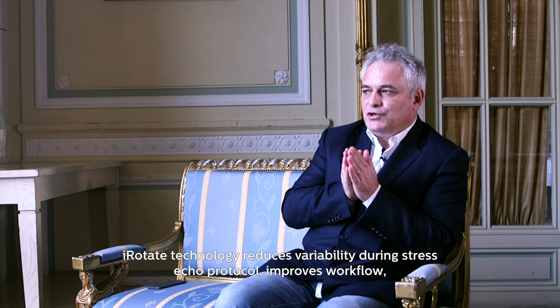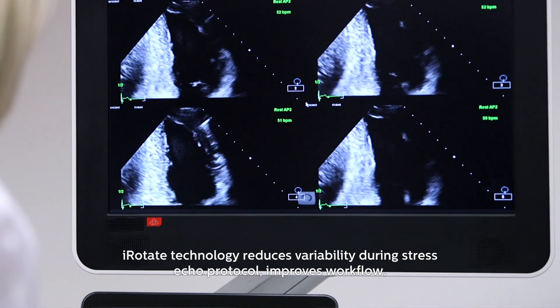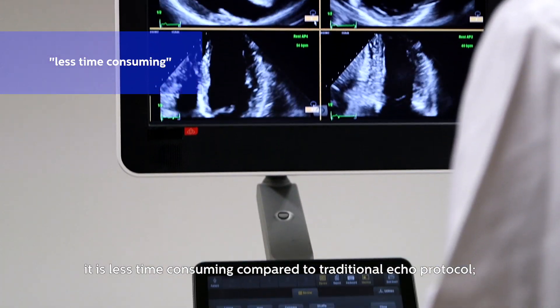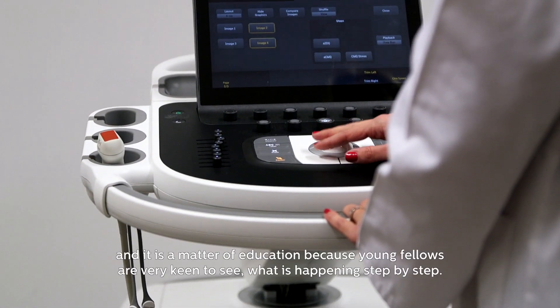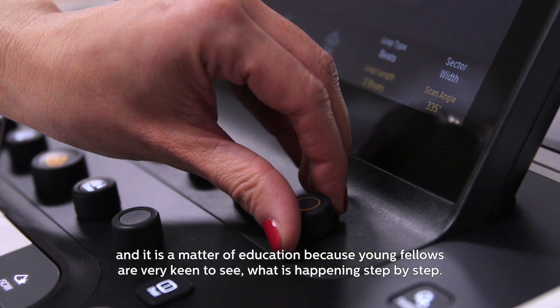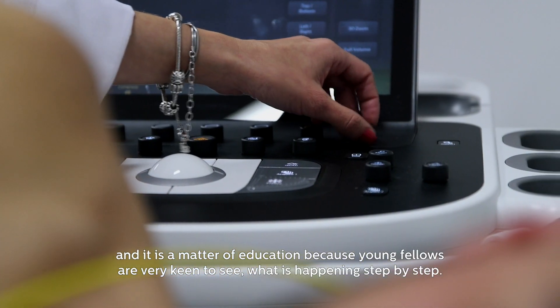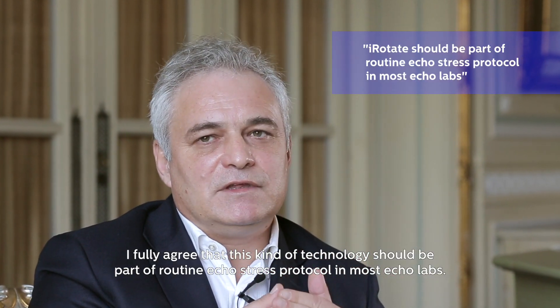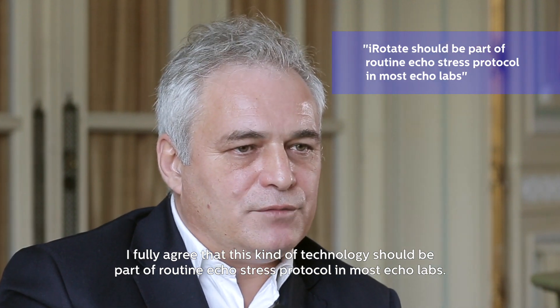I-Rotate technology reduces variability during the stress echo protocol, improves workflow, and is less time-consuming compared with traditional echo protocols. It's also a matter of education, because young fellows are very keen to see what happens step by step. We fully agree that this kind of technology should be part of the routine echo stress protocol in most echo labs.